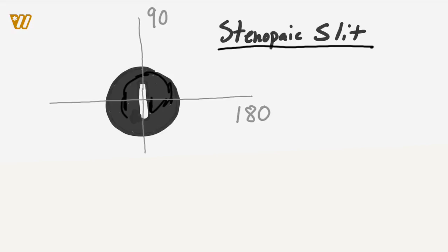Whenever they say there's one orientation where the world gets the most clear, you've just isolated one of their meridians. Then you take sphere lenses and neutralize that meridian, put it on your power cross, and you can extrapolate that and get the patient's prescription. So the stenopeic slit allows us to do a quasi-trial frame refraction in a situation where maybe you're at a nursing home or on a mission trip, where you can't use a phoropter and you don't have access to a retinoscope, and you need something else to help you. That's the stenopeic slit. It also makes for a good optics question.